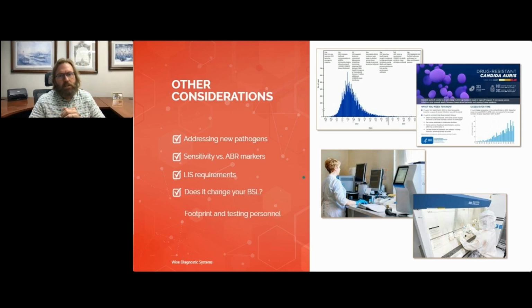A couple other considerations, and this is something that we came across too, is that when we went from the BioFire FilmArray, which was considered moderate complexity, to the Thermo Fisher platform, which was considered high complexity, one of the things that we encountered was, because it required us to purchase potentially infectious materials from various vendors, we had to upgrade our BSL level to accommodate that, which was fine. It's just something to keep in mind, because again, that's cabinets, it's equipment, it's shelf space, it's things that take up a larger footprint that you'll have to consider.